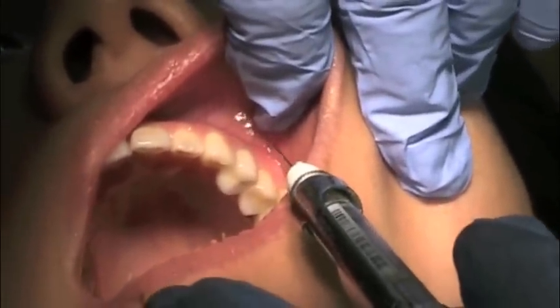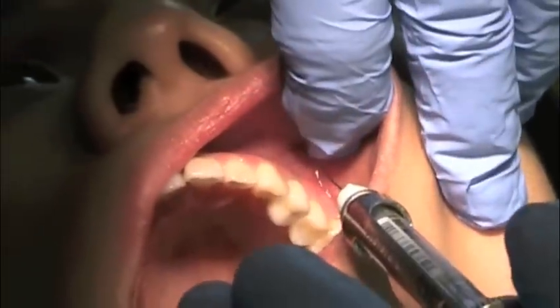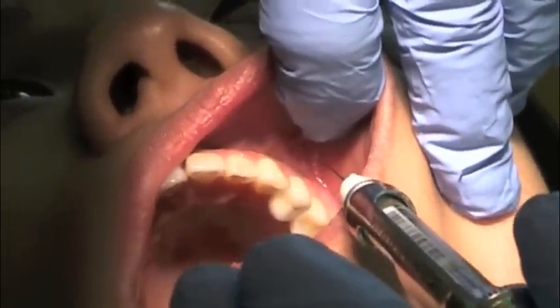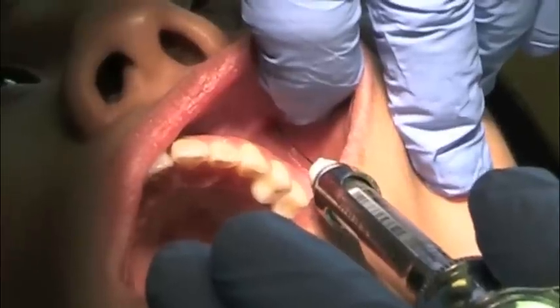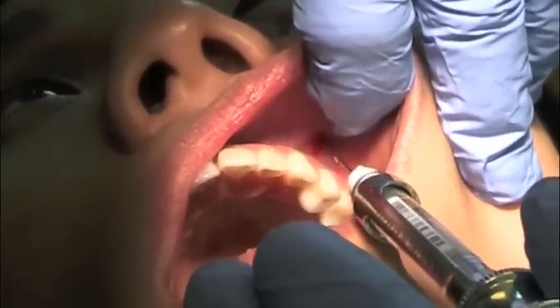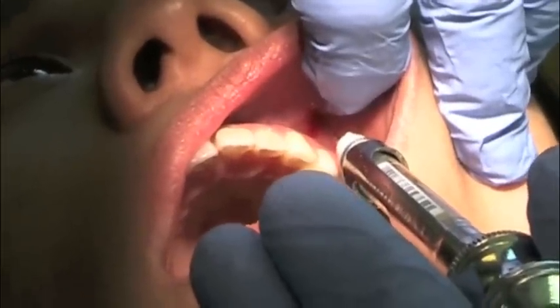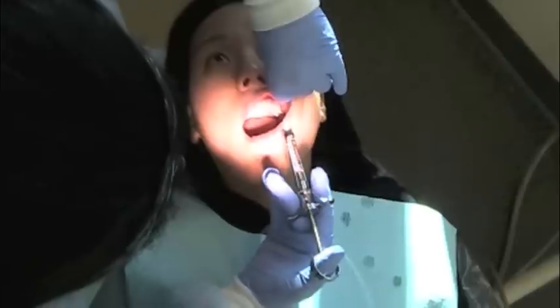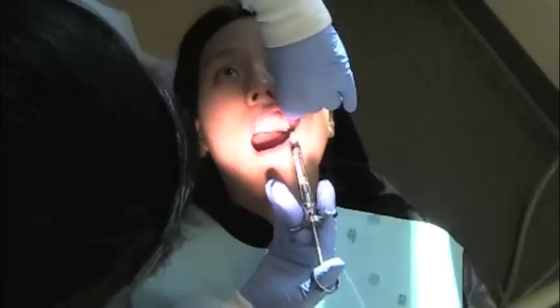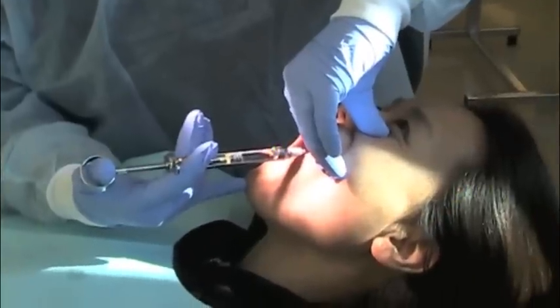Insert the needle at the mucobuccal fold, right below the infraorbital notch. Advance the needle straight until osseous is contacted. Make sure your syringe and needle are parallel to the long axis of the tooth. Make sure you have established a fulcrum by fingers or by the back of the syringe against the lower chin.